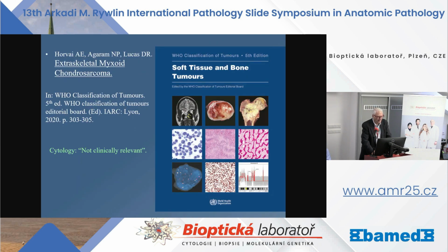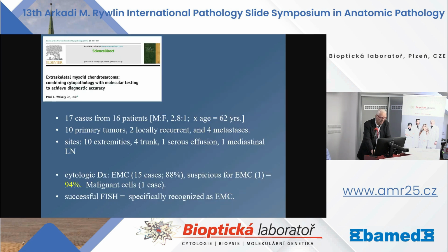Again, in the WHO classification, cytopathology, not relevant, yet in our study right in here, 17 cases, you can see we made a diagnosis of either extraskeletal myxoid chondrosarcoma, histologically confirmed or suspicious for extraskeletal myxoid chondrosarcoma in 94% of cases.